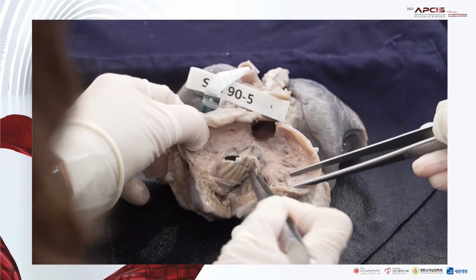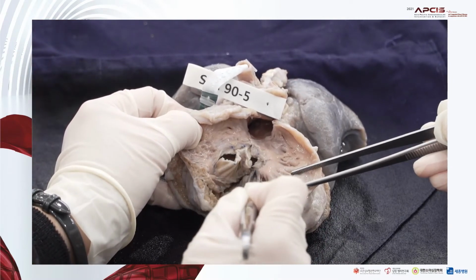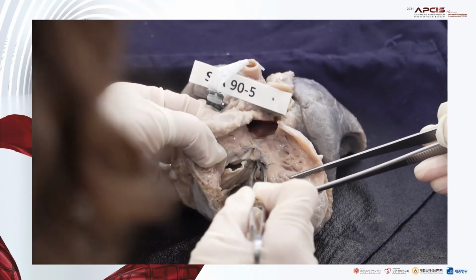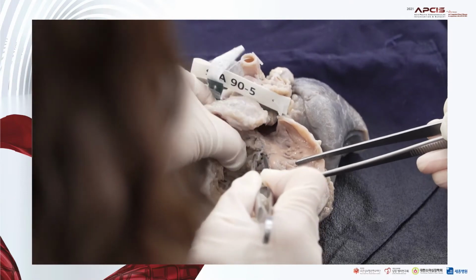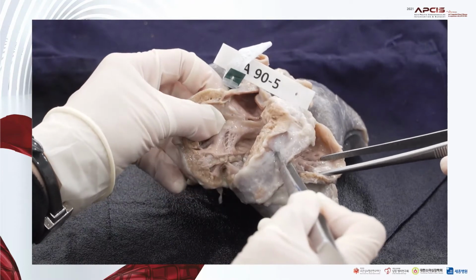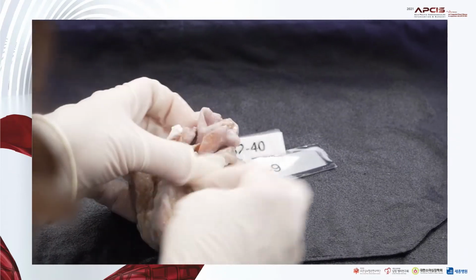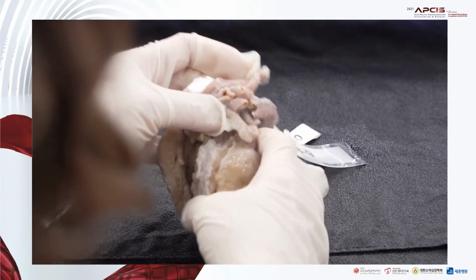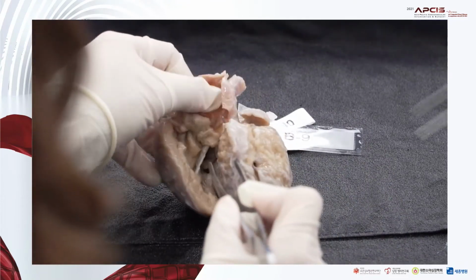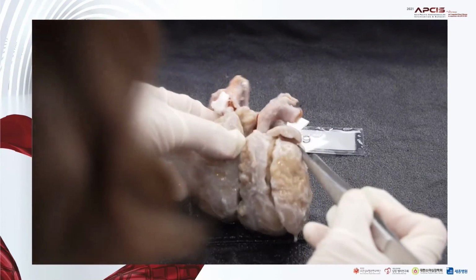This was the ventricular septal defect. The type of the VSD can be classified as subaortic, but it's not typical; it's a kind of unusual. So we have seen the typical subaortic VSD in DORV, and the unusual type of wide VSD with DORV. And this is another type.